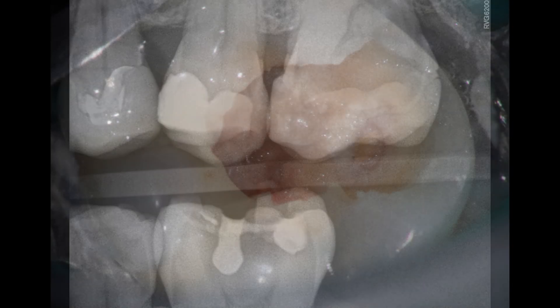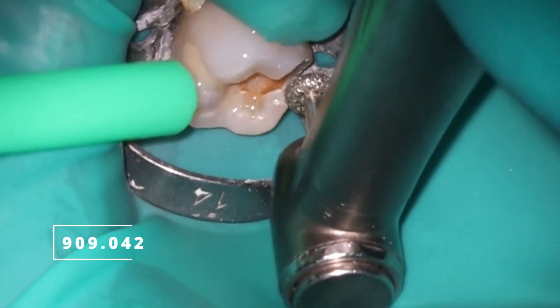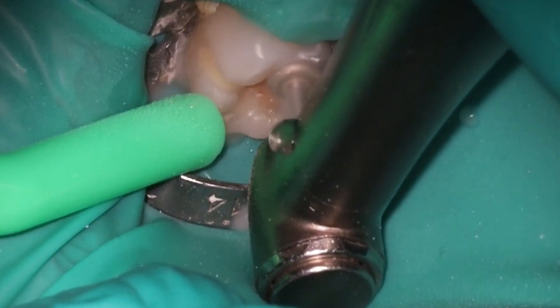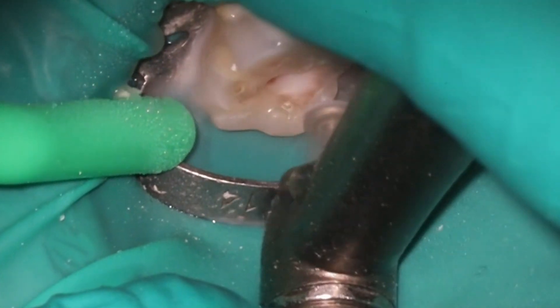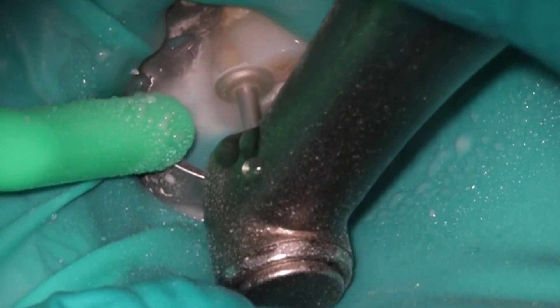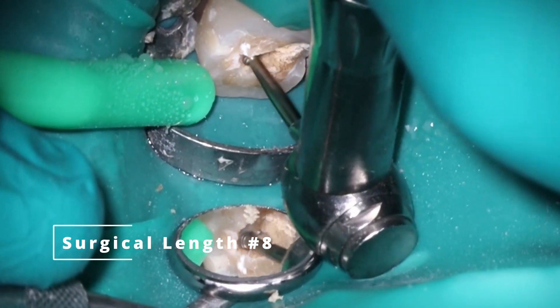Definitely caries going into the pulp there and no signs of cracks. You can see definitely nasty leathery caries and breakdown of the filling. But as we go through this process, you'll see there is actually no vertical root fracture whatsoever inside here, and we're able to get everything dry. So I ended up doing this just in a single visit. Definitely would feel more comfortable if I had something like lasers or GentleWave, but my number one thing is can I get everything nice and dry? And in this case, we were totally fine.